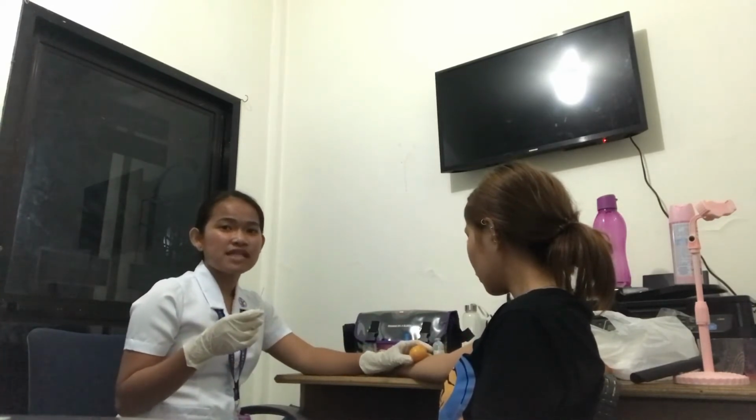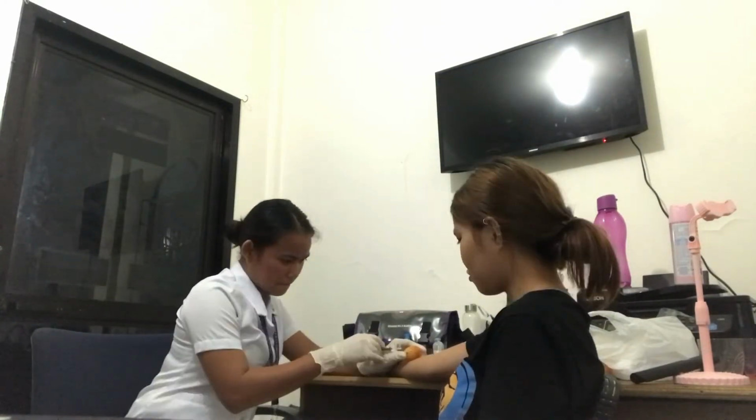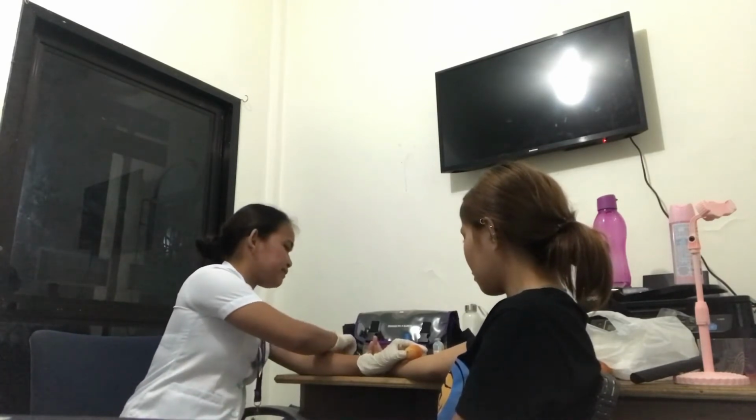Now we need to slowly inject the medication and feel the resistance until you see a bleb that resembles a mosquito bite appear on the patient's skin. After that, we can withdraw the needle at the same angle it was inserted and pat dry with a cotton ball. Do not massage the area.